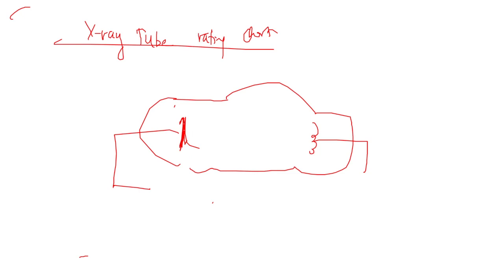That is the ability of this tube to withstand high temperature. The tube should be made in such a way that it can withstand high temperature, rapid exposures like in angiography, or multiple exposures during hours of heavy usage. So we have to see the safety limit for an X-ray tube.